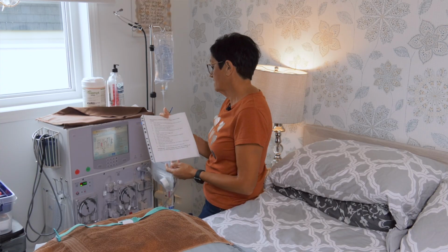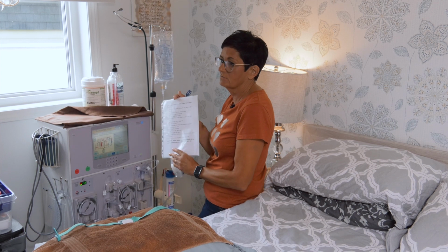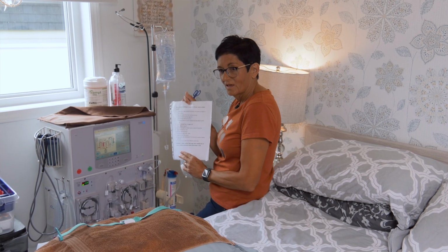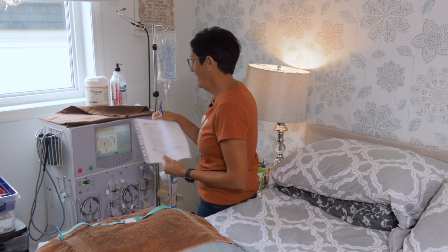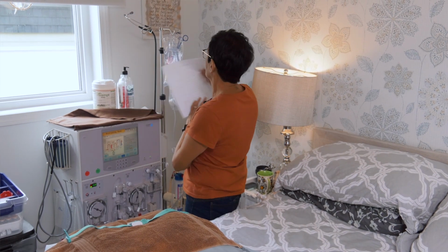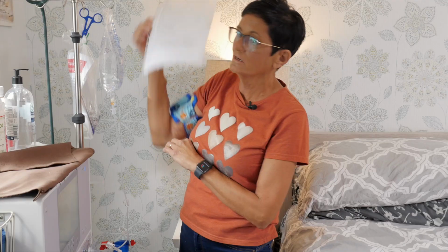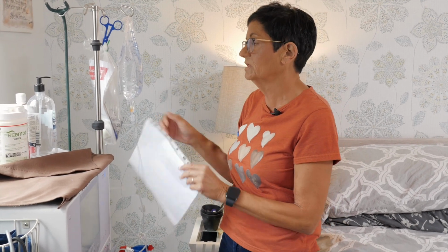It takes about 7 minutes to get all your blood back, and the machine alarms the whole time you're returning your blood. So you just have to be patient and not listen to the machine. So I always have these hanging here, just in case. I've used this once in the 6 years. That was a storm, the power went out, and I just manually returned my blood.